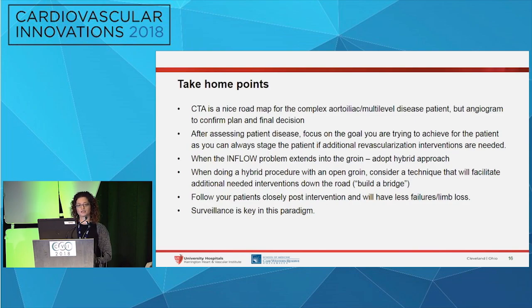When the inflow problem extends into the groin, I think adopting a hybrid approach is a very good way to do this. When doing a hybrid procedure with an open groin, consider a technique that will facilitate additional needed interventions down the line. We say don't burn bridges, but this is almost like building a bridge for later. And so I do choose to get into the SFA a little bit when I need to.